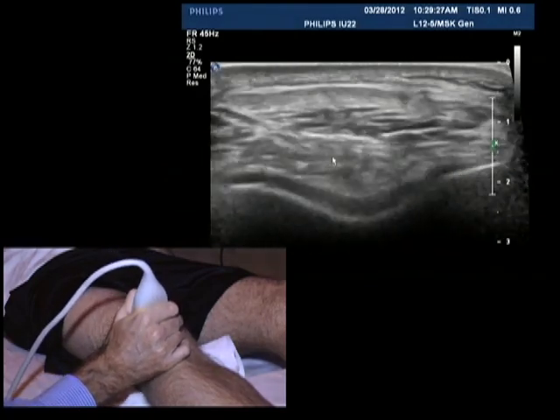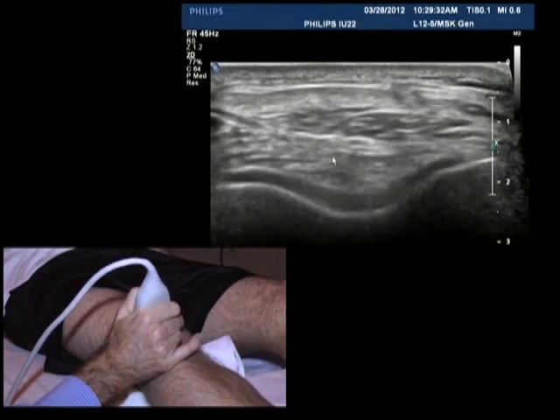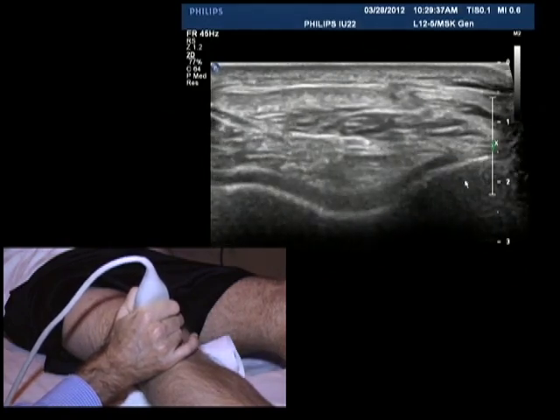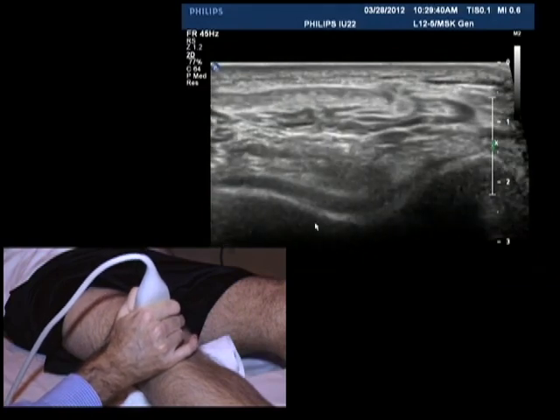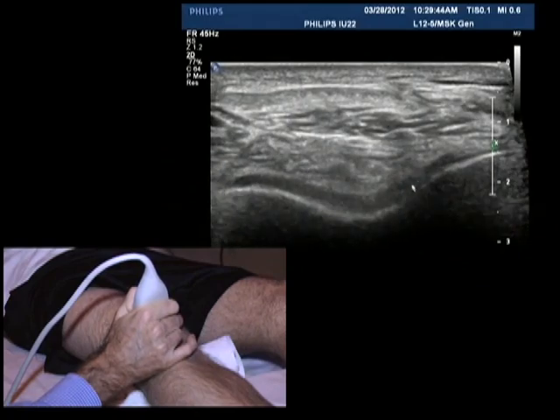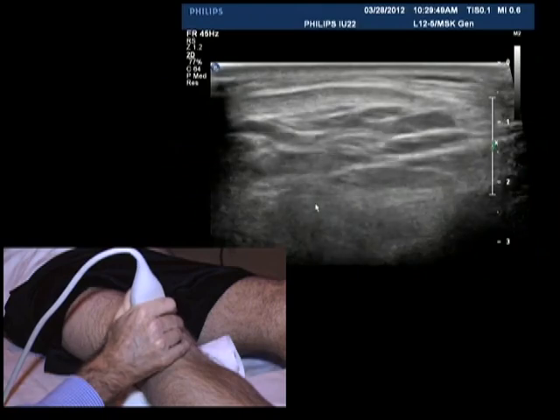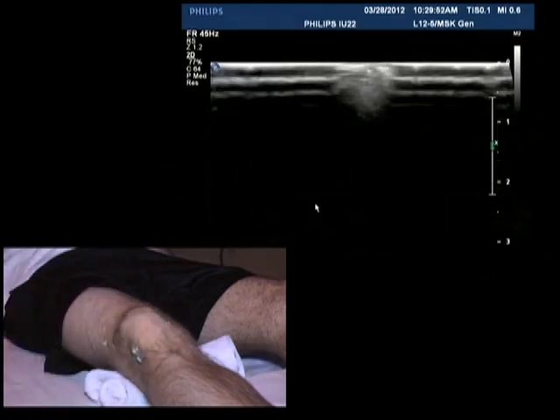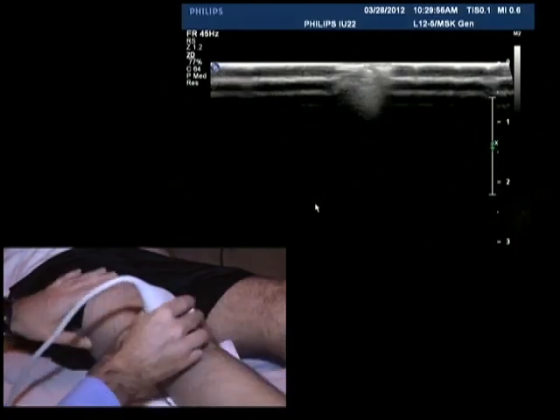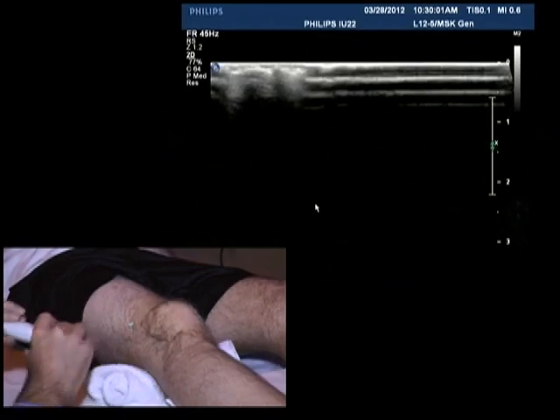Notice also we get on this view, for free, a quick look at the trochlear notch and medial and lateral femoral condyles, and then subchondral bone plate, and then some of the hyaline cartilage, the trochlear notch. All right, so quadriceps tendon and patellar tendon aren't difficult to find. All right, I'll just turn your knee a little bit. Let's have a look on the lateral side of the knee.